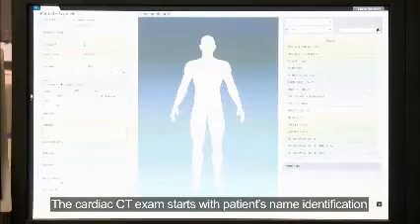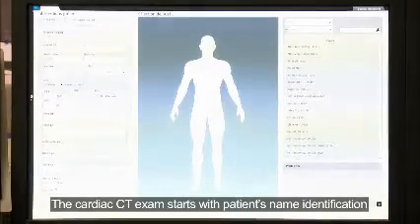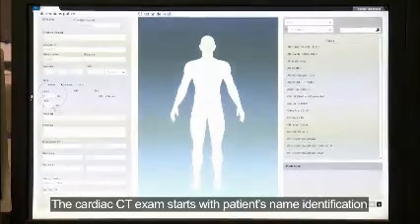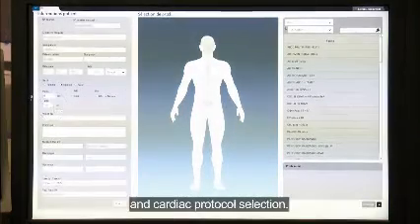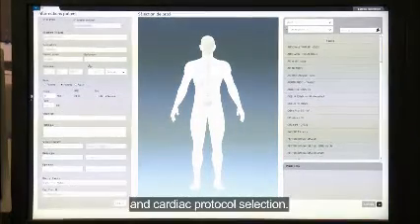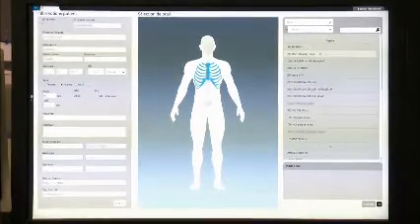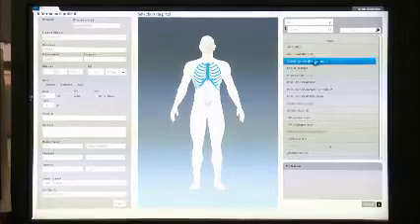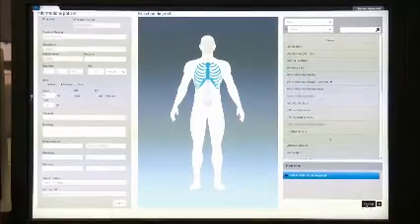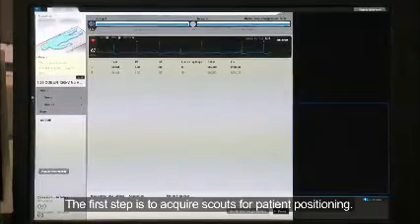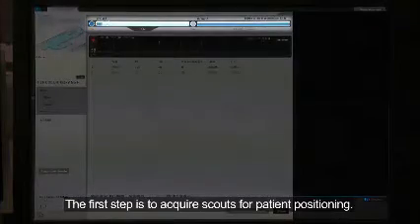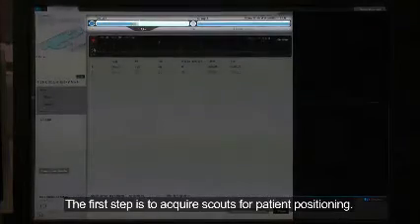The cardiac CT exam starts with patient name identification and cardiac protocol selection. The first step is to acquire scouts for patient positioning.